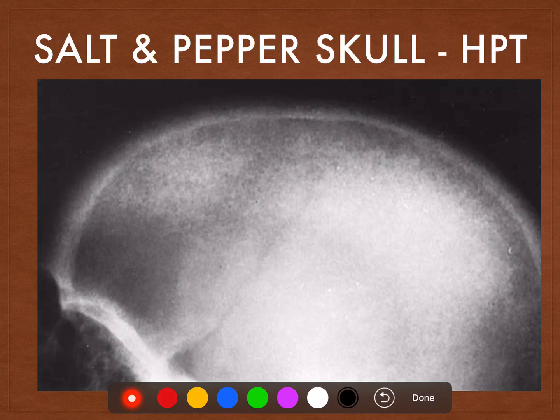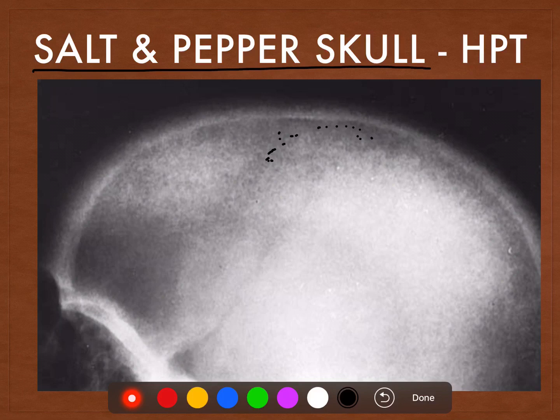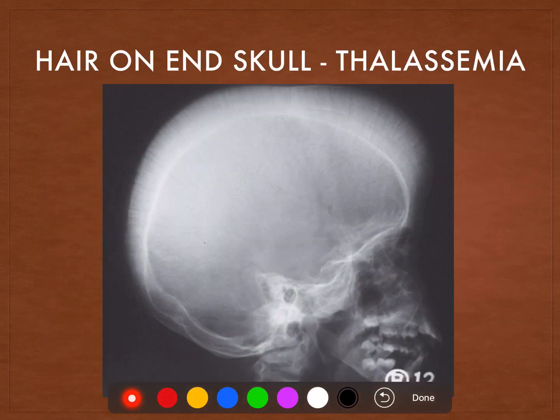Moving on, we see here multiple tiny radiolucencies in the skull and this skull is known as the salt and pepper skull. The pepper represents these tiny radiolucencies and the salt is the rest of the white normal skull. This salt and pepper skull is characteristic of hyperparathyroidism.